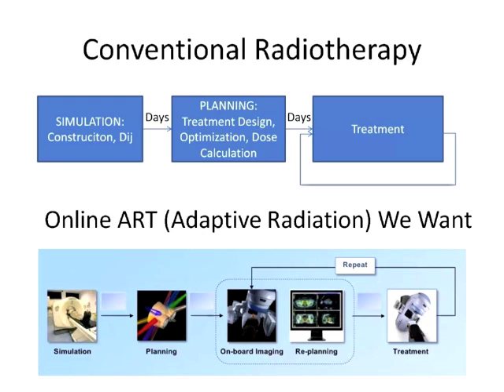Now our planning is thoroughly done, and the patient is lying on the bed waiting for the treatment. The treatment is not just a one-time radiation exposure. It has to be repeated several times.